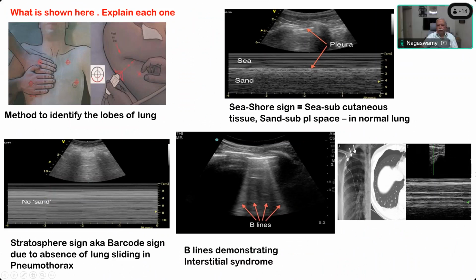We have three parts in this picture. What is this picture? What is the arrow showing here? Central line. You are not shown the entire X-ray. It is showing only one half of the X-ray. You can see the hyperlucent, more dark black shadow.